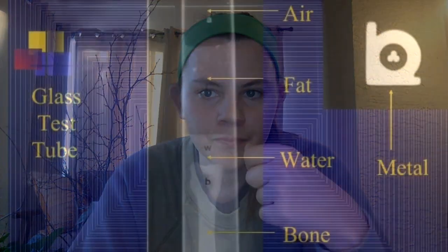Once they come through the body and they either pass or are absorbed, they end up on the other side, on that photographic film, and that's where you get those differentiations in the color. Your black is going to be air, your gray is going to be your soft tissues, your white is going to be your bone, and your bright white is going to be your metal.